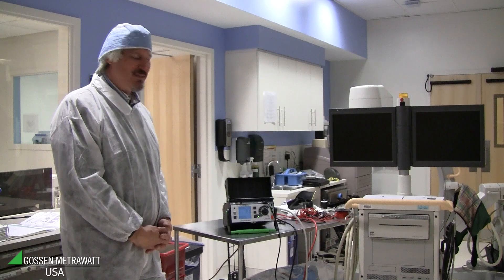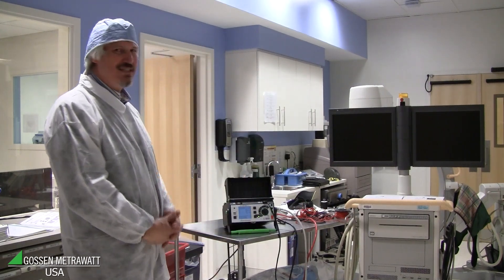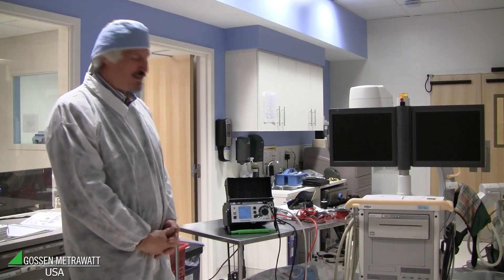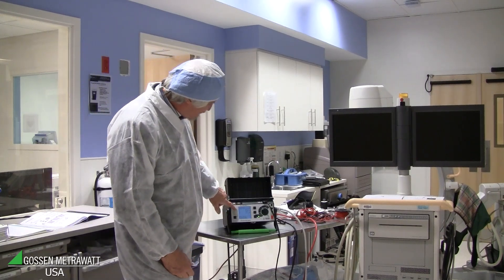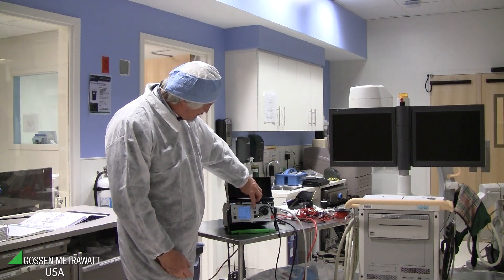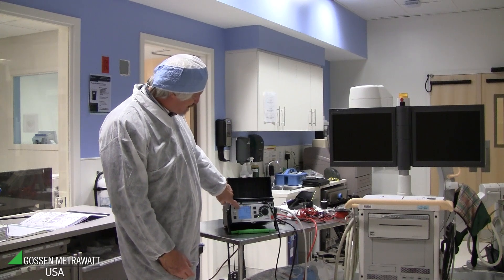But we would like to look at the single fault condition. What happens if the ground wire is broken? That can be a danger for the patient. For that reason, we look at a single fault condition where PE is interrupted. With this tester it's very easy — you just have to push the button for single fault condition. And then you see the leakage current with PE interrupted.